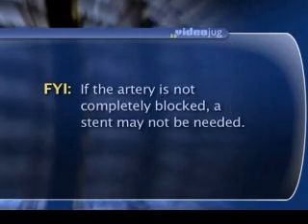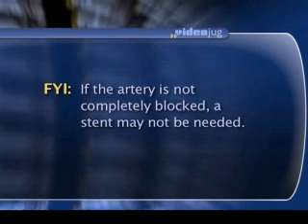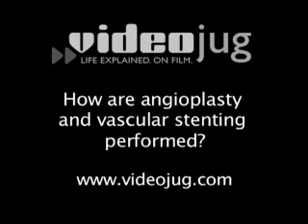Balloon angioplasty and vascular stenting are used in conjunction. There are times in which we will place a stent without previously performing a balloon angioplasty. There are also times in which we will perform a balloon angioplasty without placing a stent. That depends on the location of an area of vascular narrowing or depending on the appearance of a particular blood vessel. How are angioplasty and vascular stenting performed?